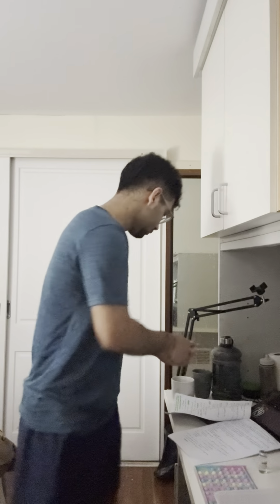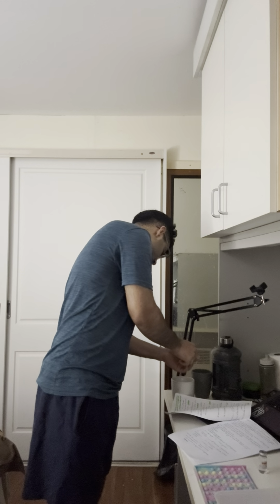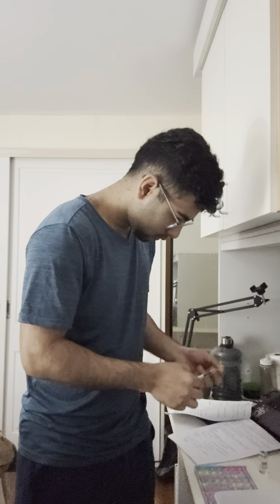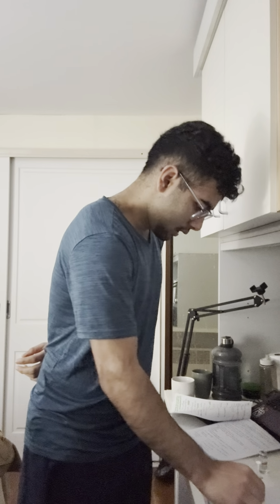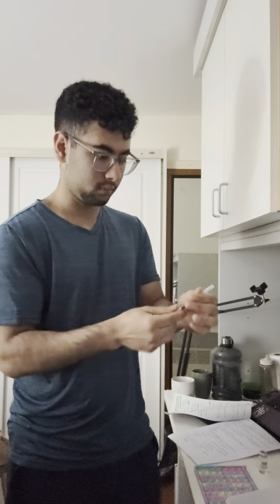Right. So it's 4 units, and never cap with your hand. Always do it like this. Never cap with your hand, because this is crucial, because most people prick themselves when they do that by themselves. Right, so you can lock it. Once my syringe is ready, the RN will have a look for me, and she will tell me, okay, you are ready to proceed.